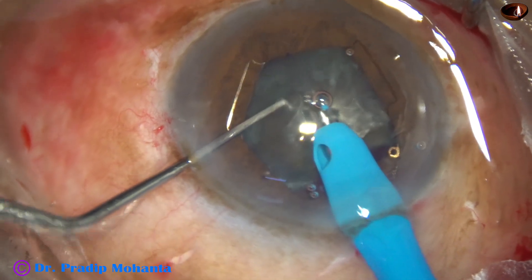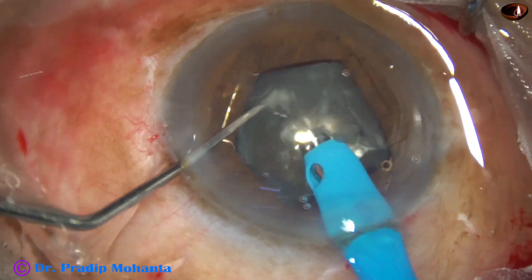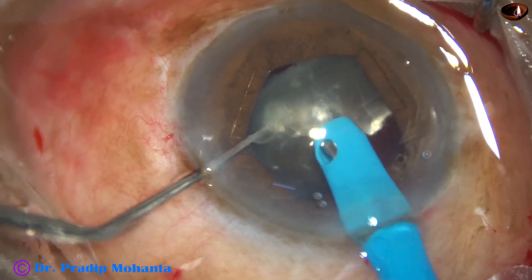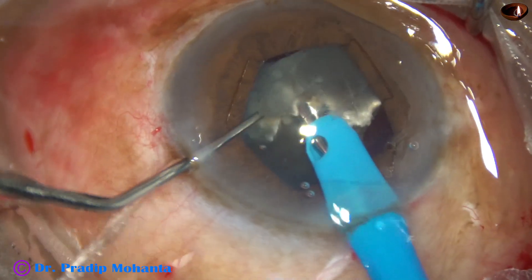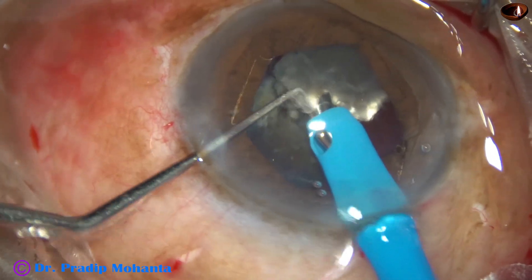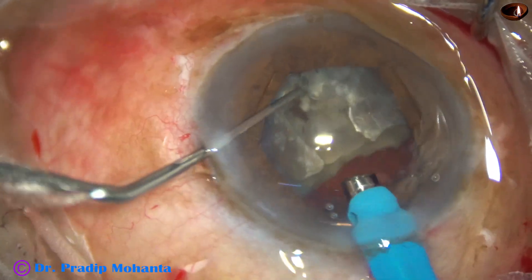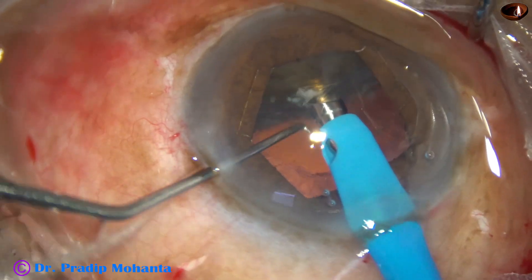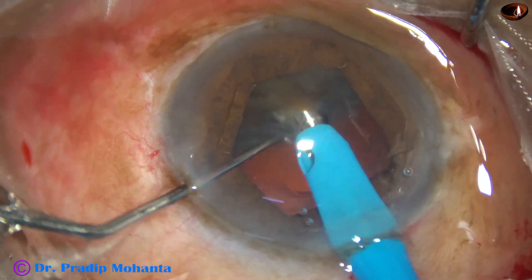Using the same technique, the tip goes into the substance of the nucleus and occludes the hemi-nucleus completely. Again I am not getting a strong hold — now I am getting a strong hold. I think I have to increase the vacuum. 450 mmHg vacuum is not sufficient for this case.